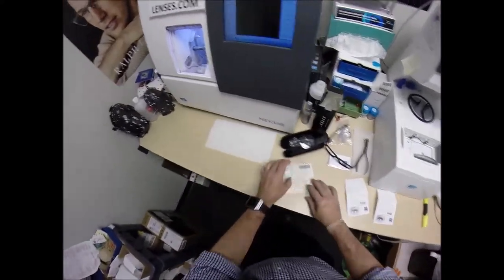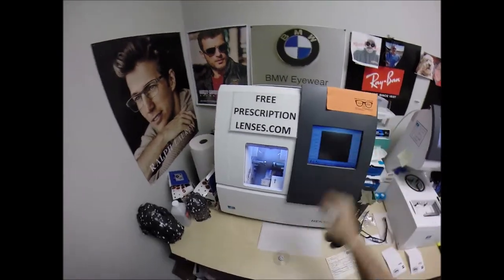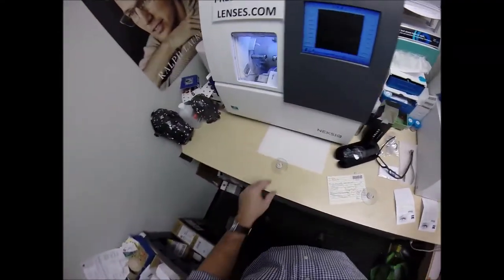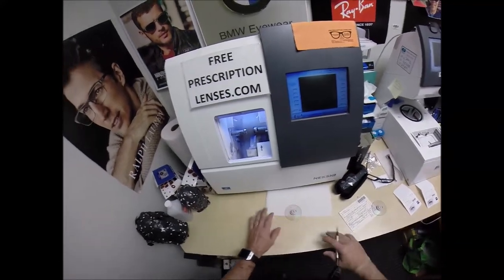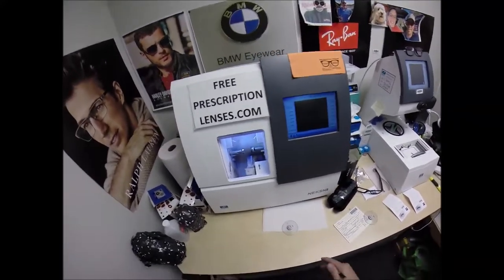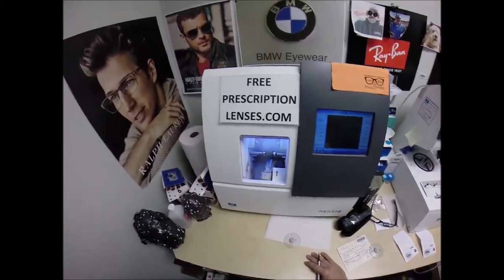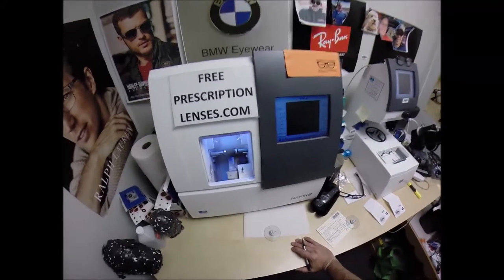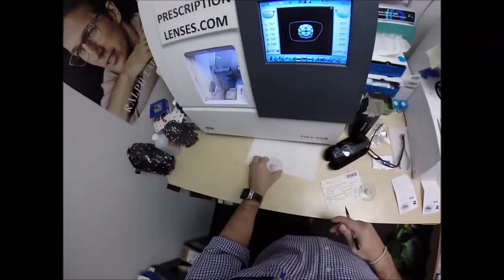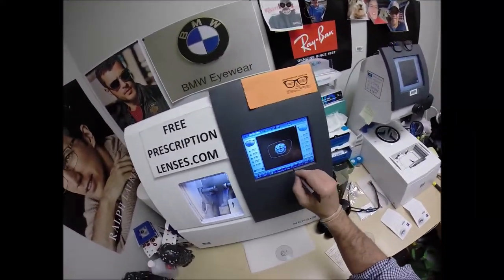From here on out, everything stays the same. This is the edger. It costs $40,000. It weighs 200 pounds. I recommend everyone go out, buy their own, put it on your kitchen counter — or on the front seat of your truck so you can cut your lenses while you're at work. I say that because Cory is a truck driver. Everything you eat, everything you wear, everything in your home has been delivered by a truck driver. Nothing gets used in this country without them. The truck driver brings me the lenses, and the truck driver is going to take the complete pair of glasses out.